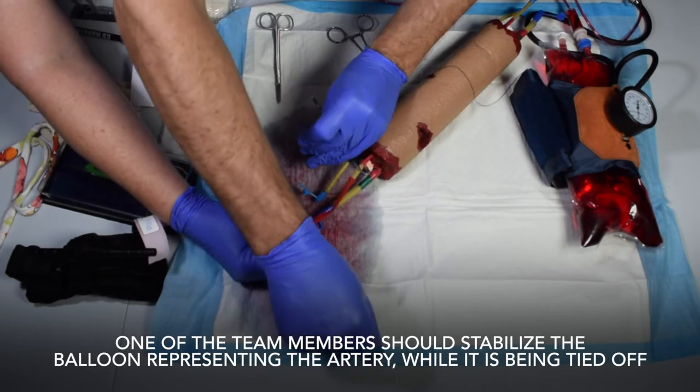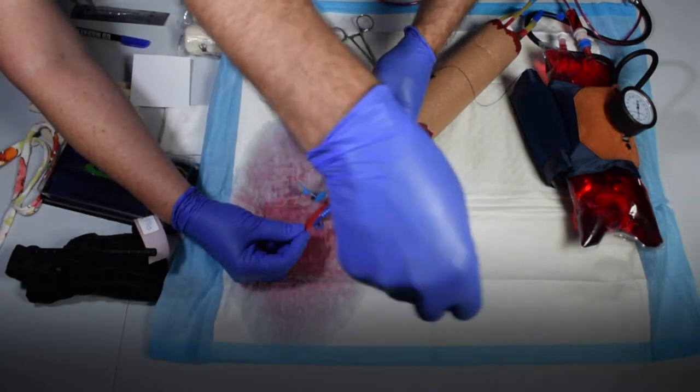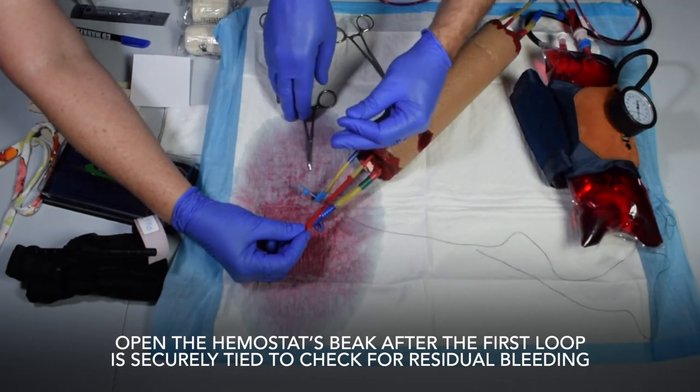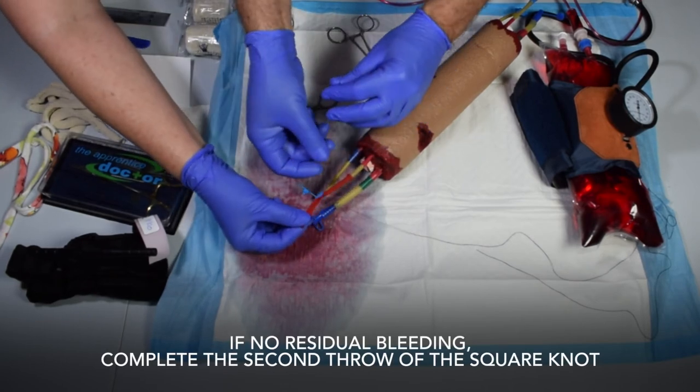One of the team members should stabilize the balloon representing the artery while it is being tied off. Open the hemostat's beak after the first loop is securely tied to check for residual bleeding. If no residual bleeding, complete the second throw of the square knot.